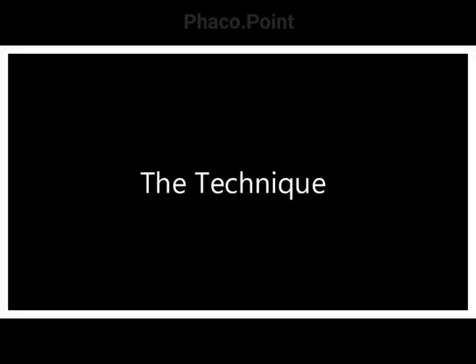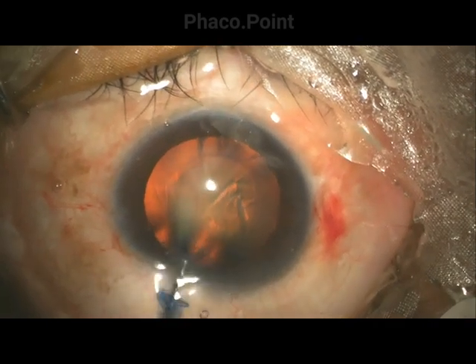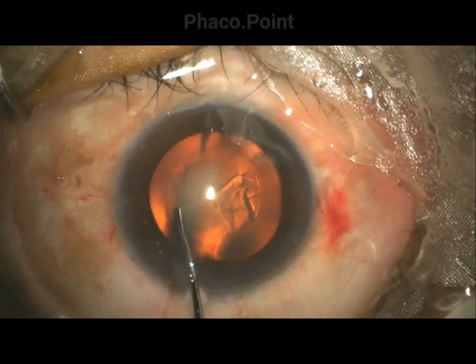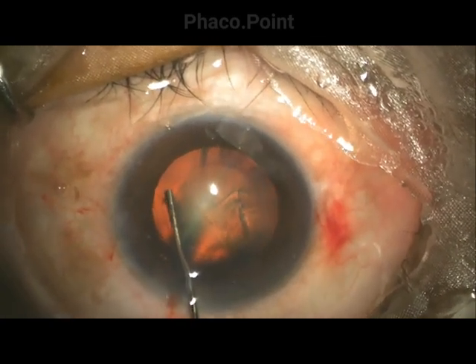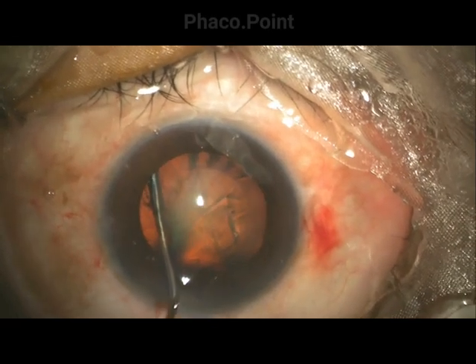At the outset, you need to press on the posterior lip of the 2.8mm tunnel to decompress the anterior chamber and make room for the hydrofluid as it exits the capsular bag. The hydrodissection cannula, duly primed, is introduced under direct visualization just deep to the capsule, elevated, and the hydro procedure carried out.